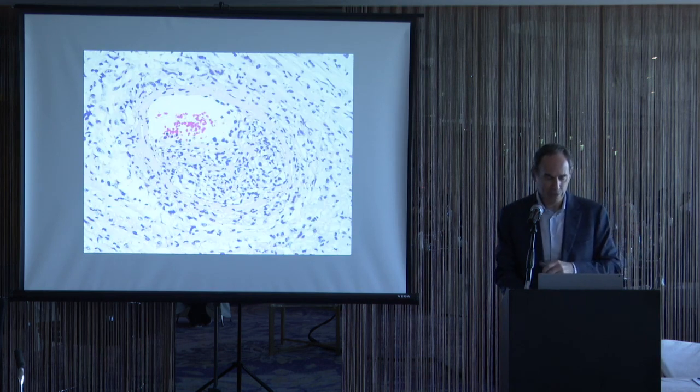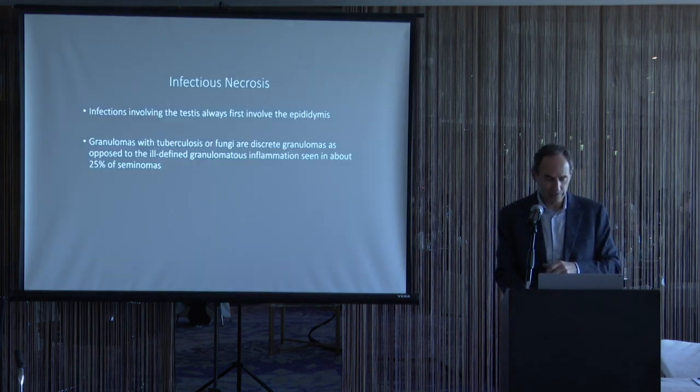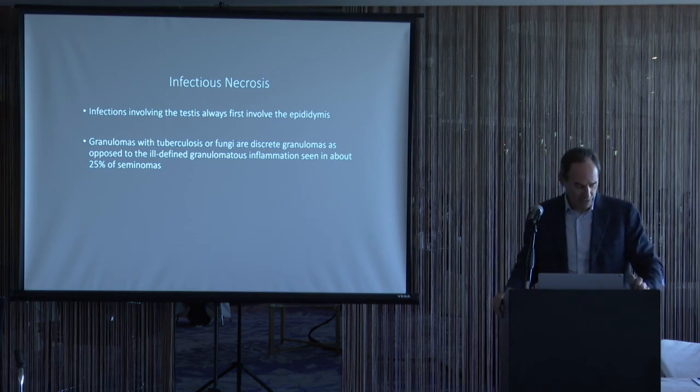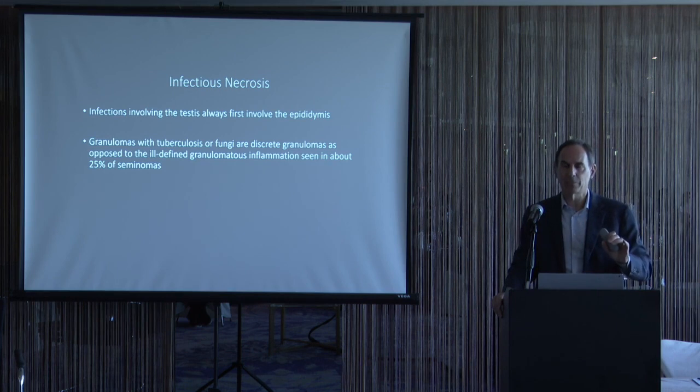Another case of granulomatous vasculitis associated with an infarct. Infectious necrosis: the key thing with any infection involving the testes is that it always affects the epididymis first. So if you do not see epididymal involvement, it's not an infection of the testes.